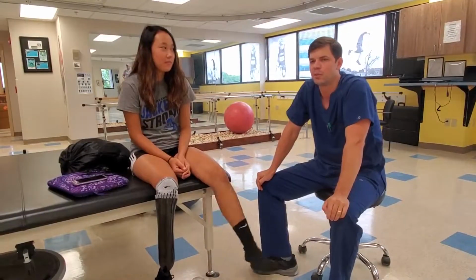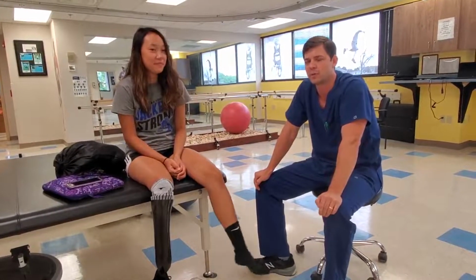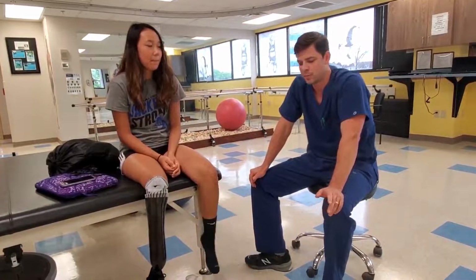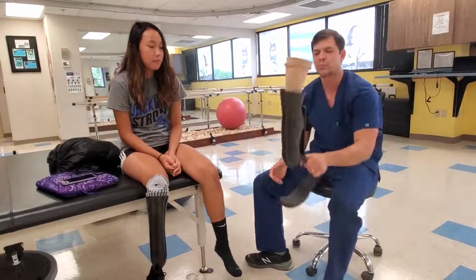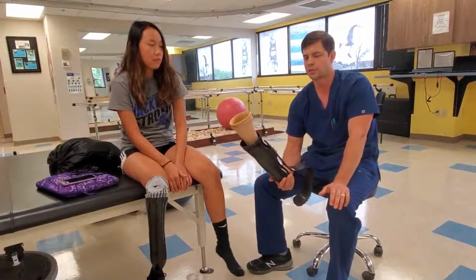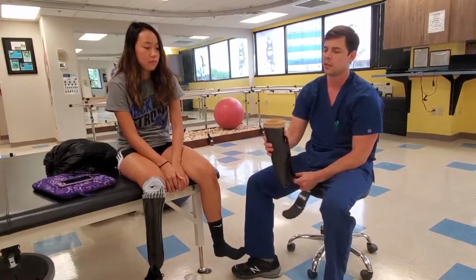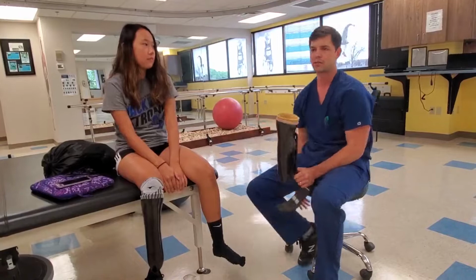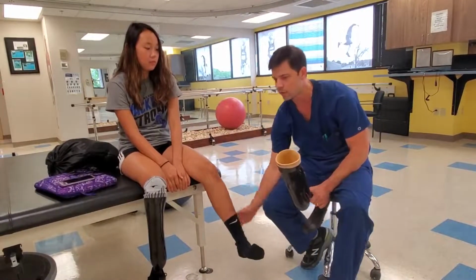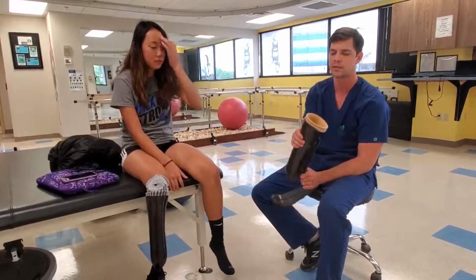This week we worked with Katie Switzer, who hails from Kentucky, about 4 to 5 hours away from here. So they drove in on Sunday to get started with us. Katie's been a successful user of a posterior mount P-light system for several years now, but the main reason she was here this time around is because she was having some fit issues of her residual limb inside of the socket. Katie has gained about 10 pounds in about a year and about 2 centimeters of volume all the way through her residual limb. So that created a lot of fit issues with her current P-light and socket setup here.